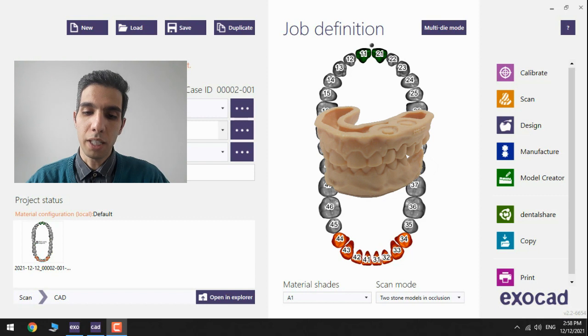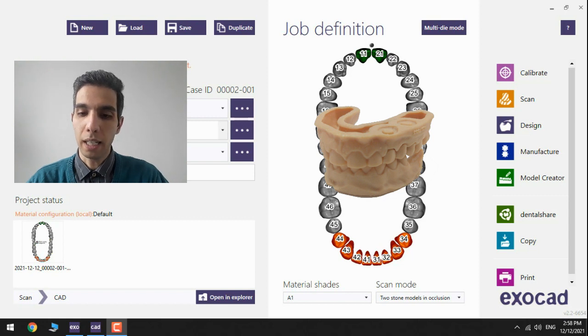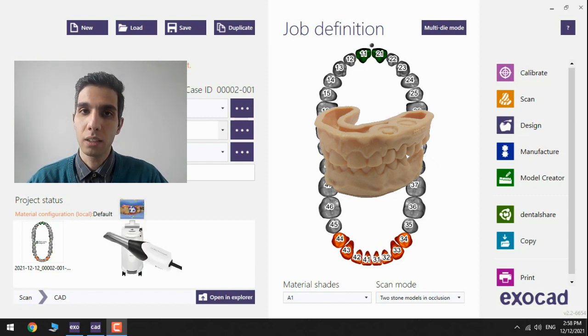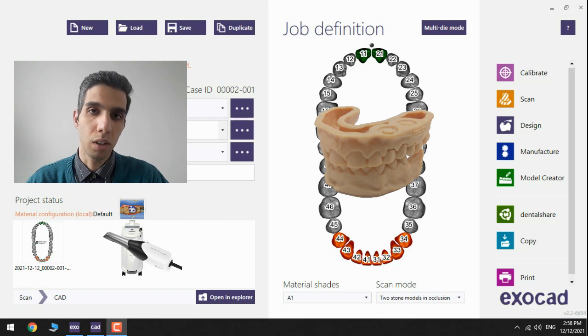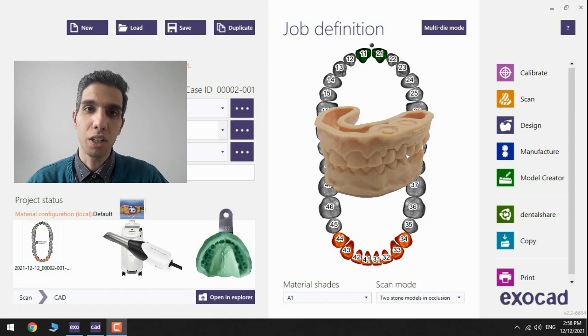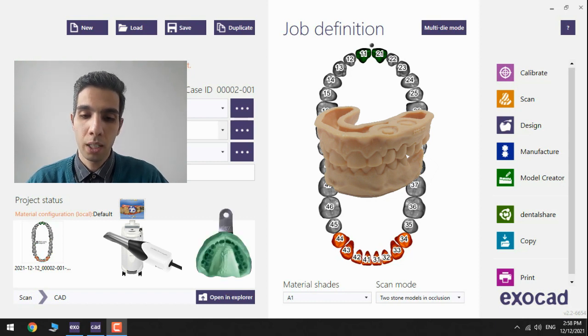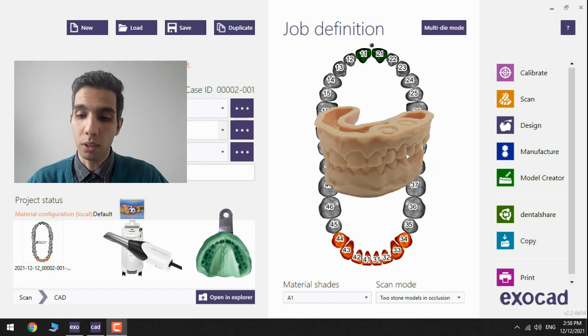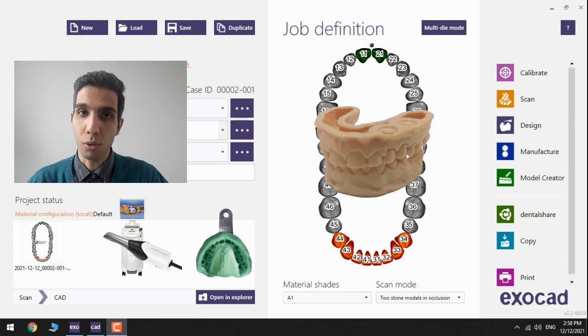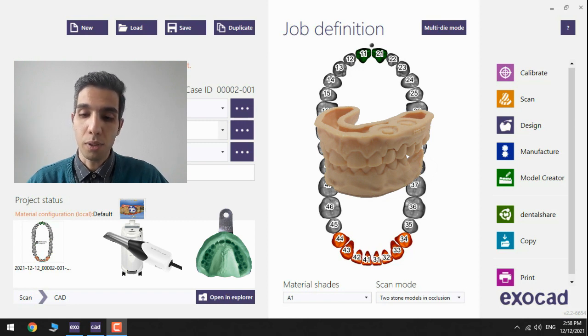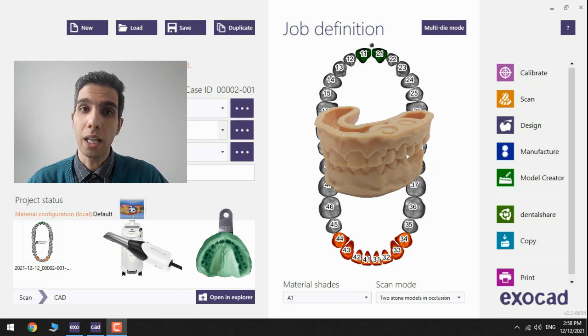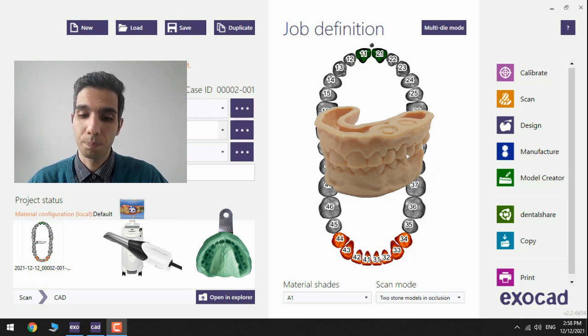With Exocad Model Creator you can create physical models from intraoral scan or alternatively from a conventional impression. Most designs of models with detachable segments or monolithic models are supported with the software, and it's also possible to create models with lab analog and removable gingival mask with the additional implant module.